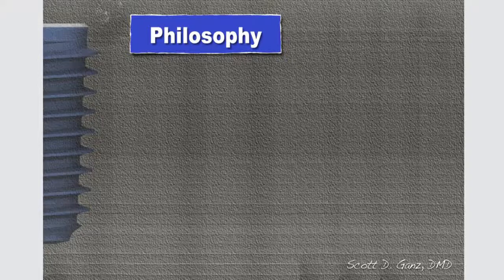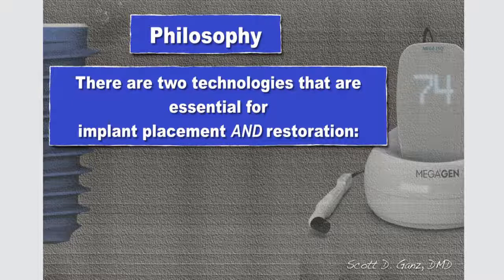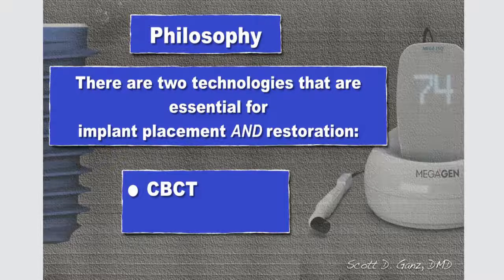So, philosophy. My basic philosophy, which you might want to think about, there are two technologies that are essential for implant placement and restoration. Placement and restoration, meaning surgical and restorative, and that's Cone Beam CT, that's the basic foundation, and then RFA ISQ, implant stability quotient, resonance frequency analysis.